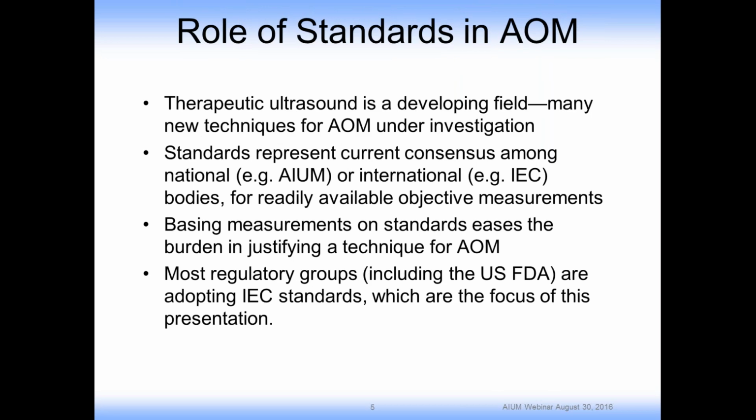I want to take a moment to describe the role of standards in acoustic output measurements. Therapeutic ultrasound, and it's worth noting that therapeutic ultrasound is a developing field, has many new techniques for acoustic output measurement under investigation for this application. Within this context, standards represent current consensus among national, for example, AIUM, or international, for example, IEC bodies that represent consensus for readily available objective measurements within this context.